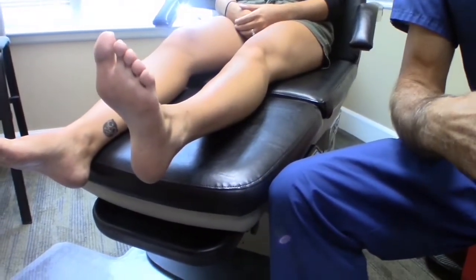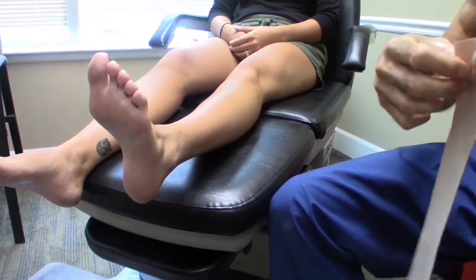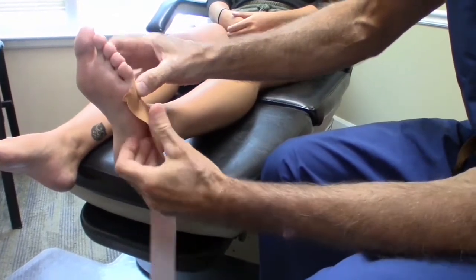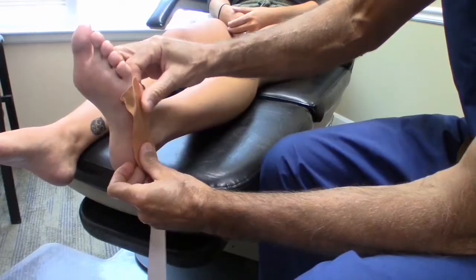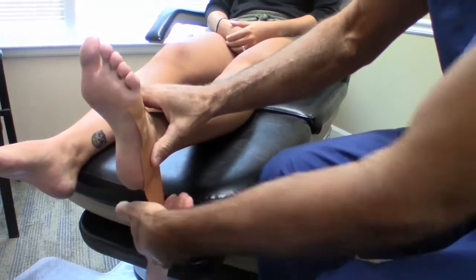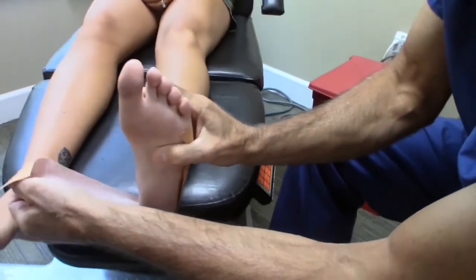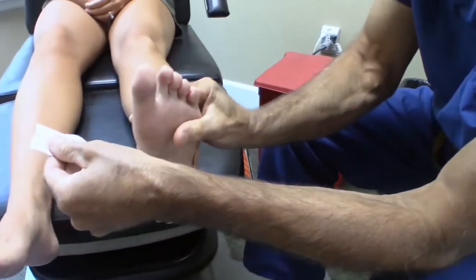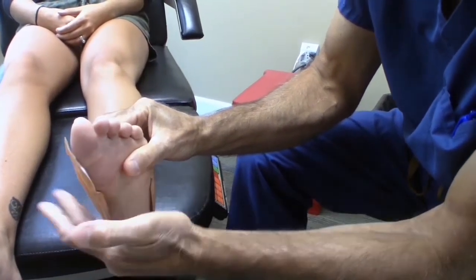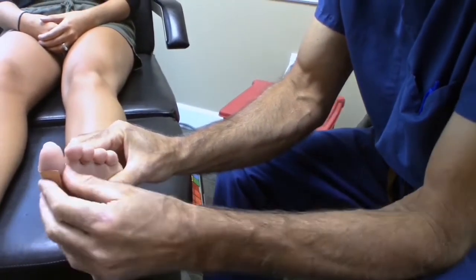We'll start with the first strip, and the important thing is positioning the foot properly. Typically you start with the tape right there and run it along the heel — I try not to get wrinkles in it because that won't be real comfortable. Once you get it around the heel, you want to grab the foot, bring this part of the foot down to make an arch, and stick that down like that. If you have any excess left over, you don't have to leave it on the toe — you can cut that later.